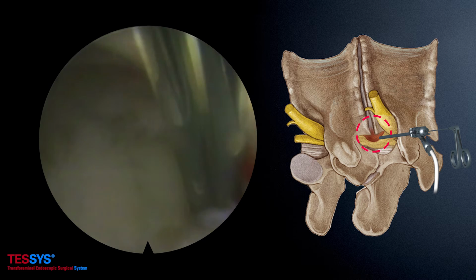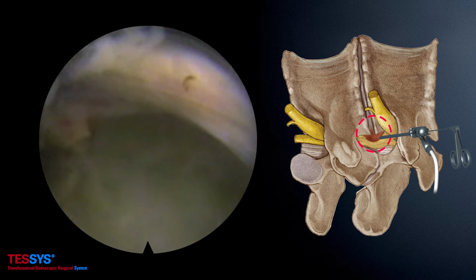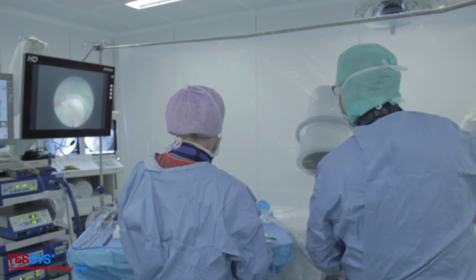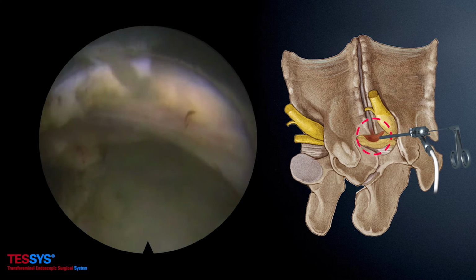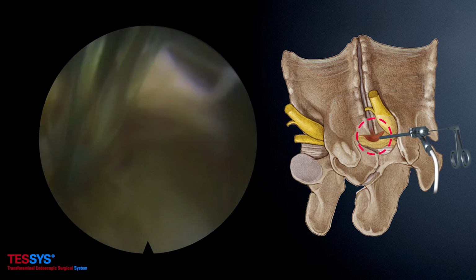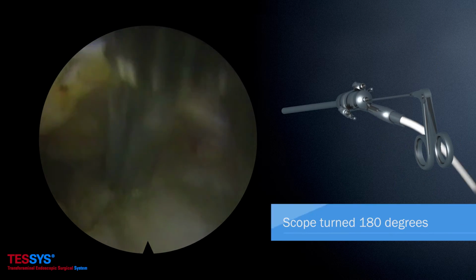Pull out the cannula and foramenoscope a little and follow and decompress, if necessary, the exiting nerve till it leaves the foramen. Now we have a clear view of the exiting nerve root L4 in the foramen, where it leaves the foramen laterally. In case of a pure foramenal disc herniation, the job is done.